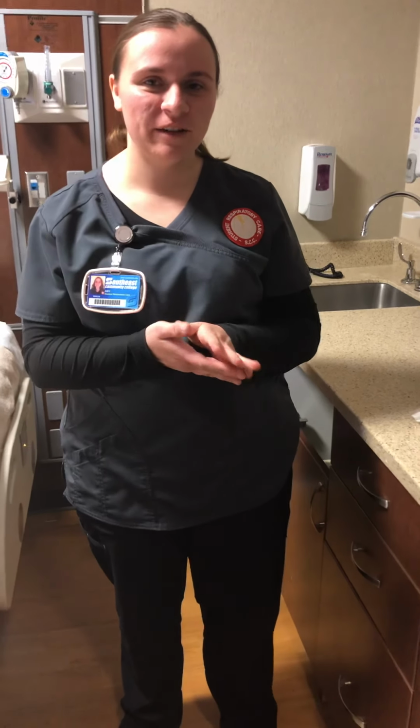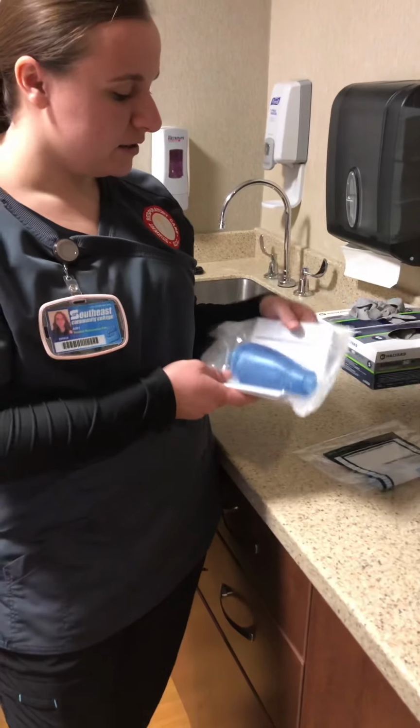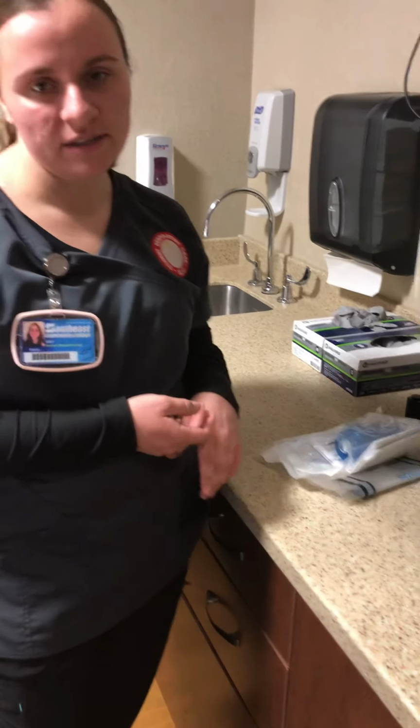Alright, so today I'm going to do an airway clearance, and today I'm going to do it with an acapella. This will help them get their secretions out of their lungs and help them breathe better. First off, I'm going to check the patient's chart before I enter the room to see if they have a nebulizer treatment, so that I can do it before and then after their treatment. That way I can get their lungs cleared up after treatment.